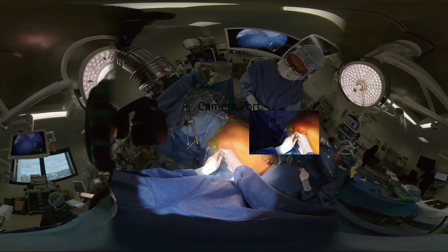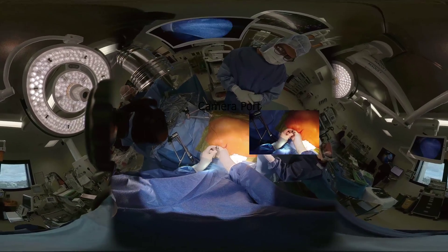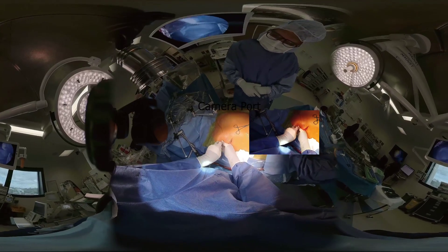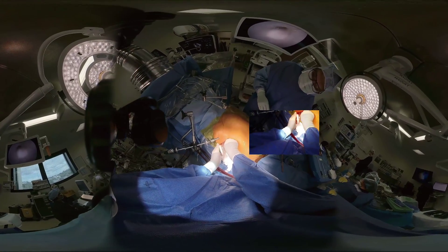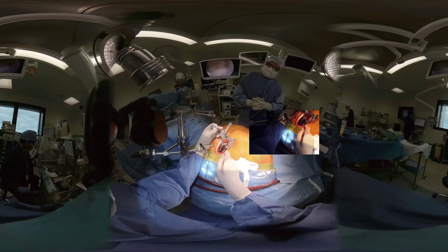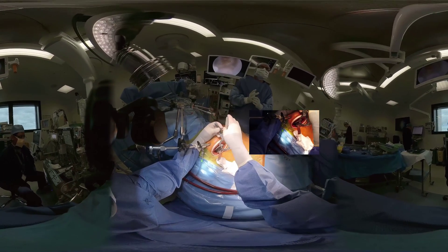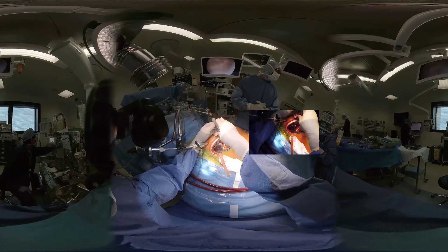An endoscopic 0-degree camera is placed through a 10 mm port, one space above the minithoracotomy. Carbon dioxide is connected to this port to insufflate the pleural cavity to minimize the risk of air embolism. The minithoracotomy is accessed using an Alexis soft tissue wound retractor and a small rib retractor such as the Gister minithoracotomy retractor. This rib retractor is placed on top of a malleable plate to retract the diaphragm, which will later be used to retract the inferior posterior wall of the left atrium.